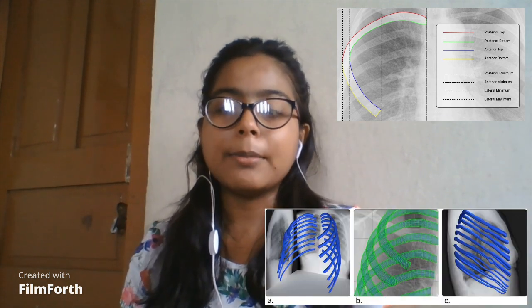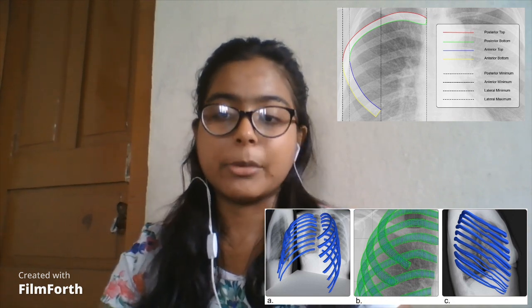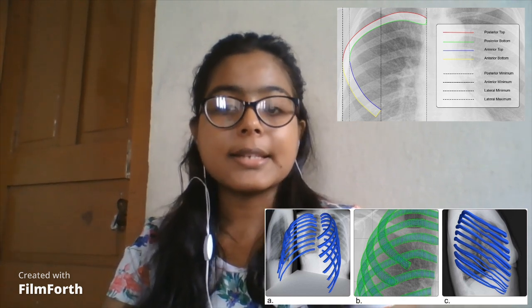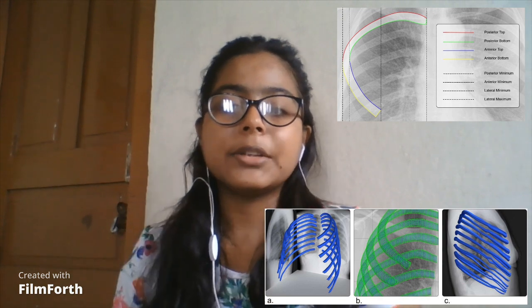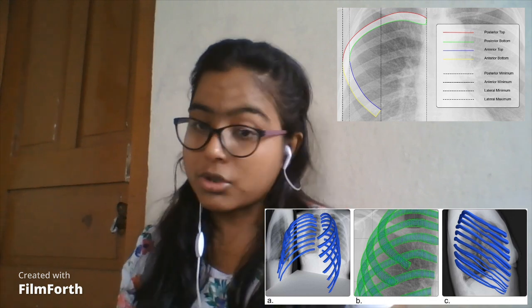After the template has been aligned with the x-axis, the clusters of the vertices are aligned one by one along the y-axis. This step finally gives the 3D model a near perfect alignment with the segmented ribs in the PA X-ray image. Each subcluster in the posterior cluster is scaled and transformed so that the vertices with the maximum and the minimum y coordinate values are aligned with the y coordinate values of the segmented edges corresponding to the top and the posterior rib.